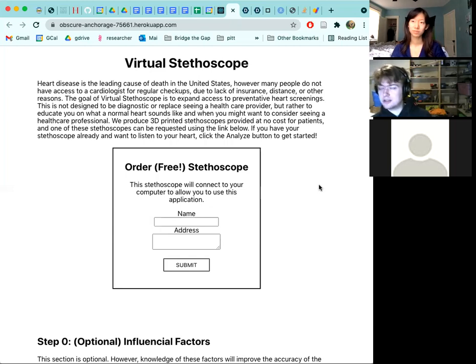However, a simple approach to a stethoscope app, just pressing the phone against the chest and using the phone's microphone unmodified to listen to heartbeats, was only able to get 75% accuracy. So pushing forward, we would want 99.5% accuracy or better for diagnostics, which will mean both improving the model and moving from just using a phone microphone to using the 3D printed stethoscope, which other people have proved can get to the same effectiveness as a professional stethoscope.